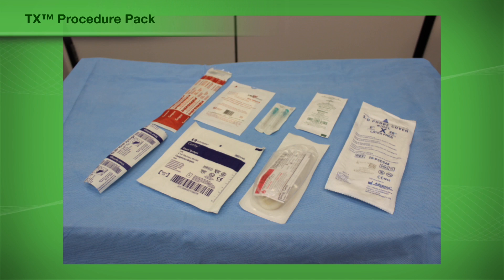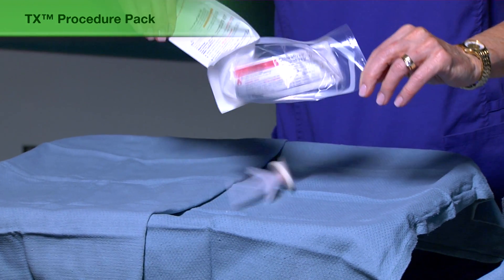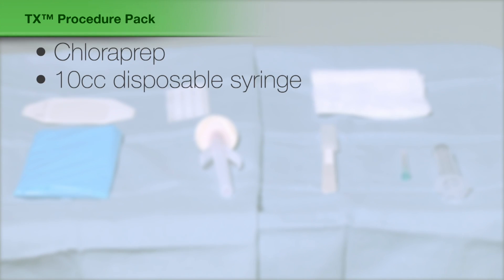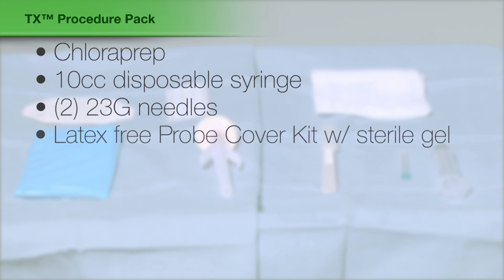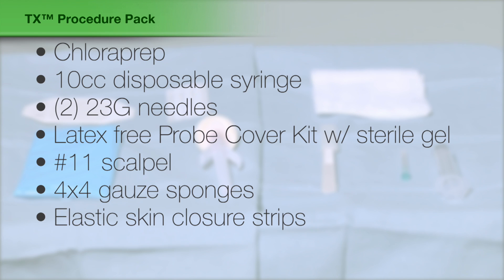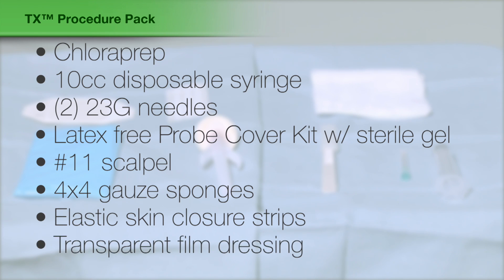The TX supply kit contains prepackaged sterile items for use during the procedure. Each item should be opened and dropped or placed on the sterile field. The tray includes chloroprep, a 10CC disposable syringe, two 23-gauge needles, latex-free probe cover kit with sterile gel, a number 11 scalpel, 4x4 gauze sponges, elastic skin closure strips, and a transparent film dressing.